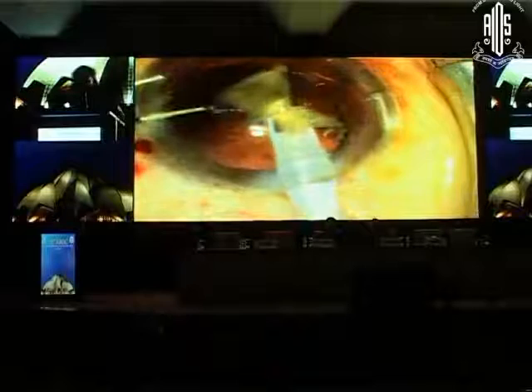So when you are doing this piece, and you know what, there is always a relief in the surgeon's mind that thank God it's over, and you may make a mistake at this time, which is what I have done. After doing mad cats and brown cataracts, I have heaved a sigh of relief only to see the PC getting captured in this and getting a PC rupture.